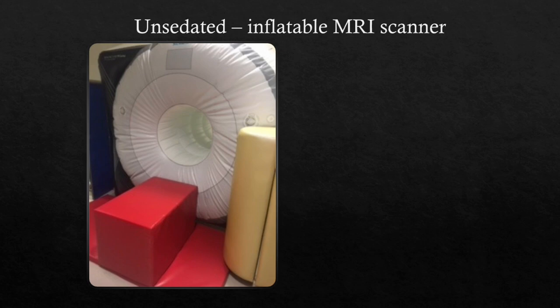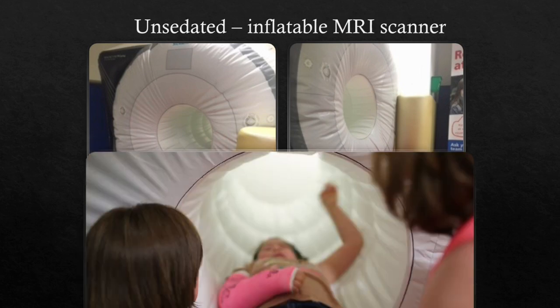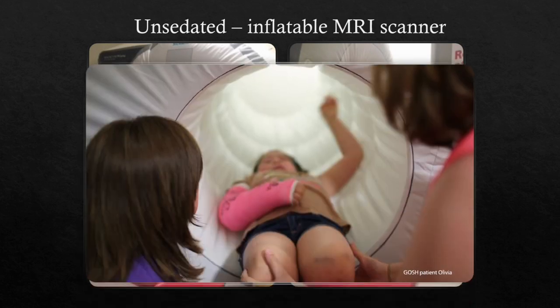They can jump about in it, go in it, practice lying still, and it's been a really useful tool and has helped to prepare patients. Sometimes, if they're in the hospital a day before, they can come in, have a go, have a practice. And then we have an example of one of our patients, Olivia, trying it out for us, and she did a brilliant job.